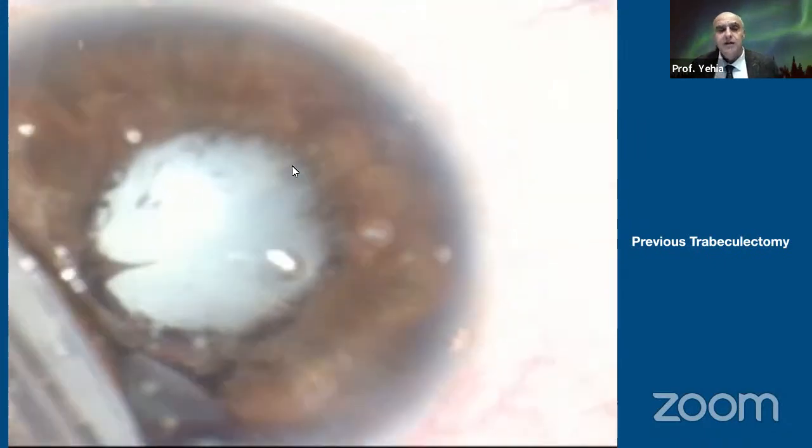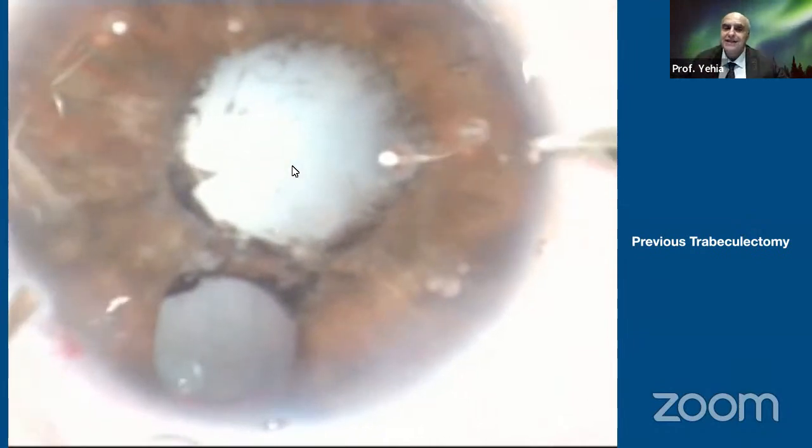This is a patient who has had some sort of glaucoma surgery before. You see a huge iridectomy. It seems it was complicated. The iris is flaring, it could have been a secondary glaucoma, there is posterior synechia all around, and a mature cataract. Then again, it's a shallow anterior chamber. So you have to face the challenge in a stepwise manner.